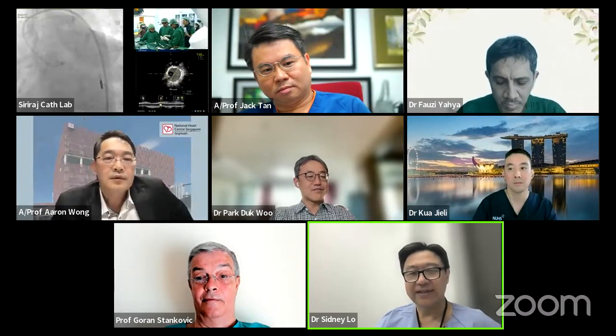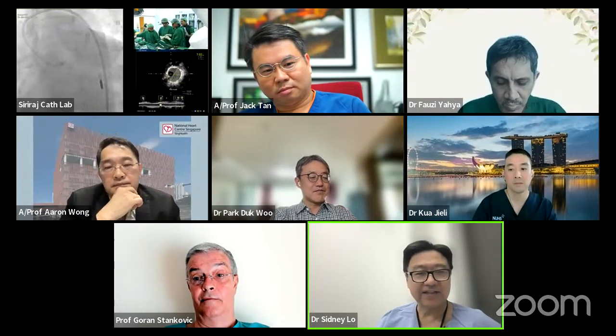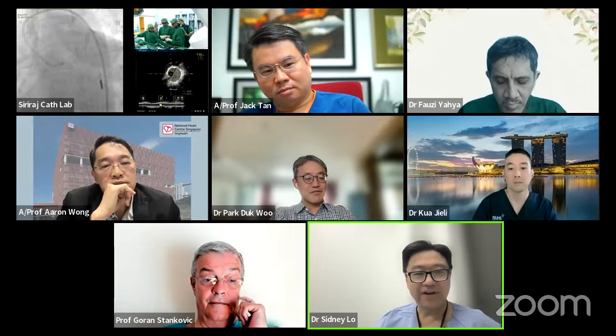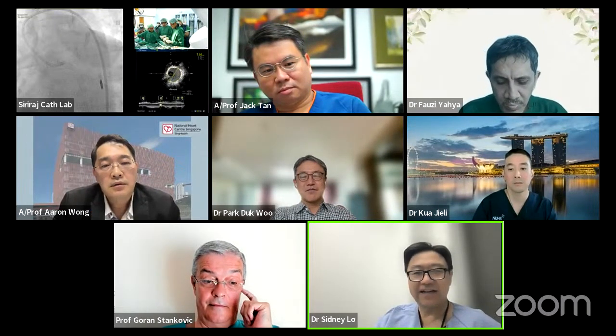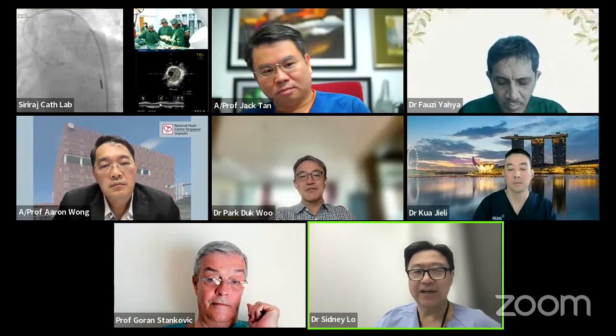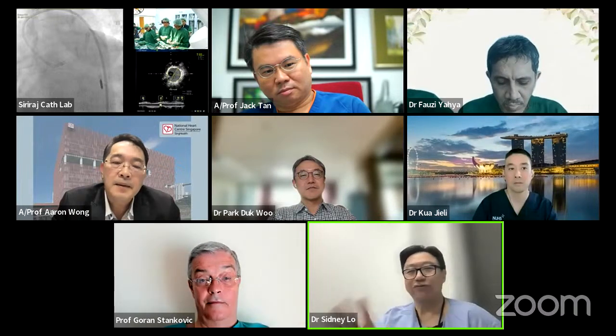My problem is sometimes the left main is 8 and there's no stent big enough to touch it. Maybe you think it's a 5.0, but it's a 6 or an 8, and you don't get a stent big enough. So I think imaging, particularly for left main stenting, matters, and we'll see the randomized trial data coming up soon.